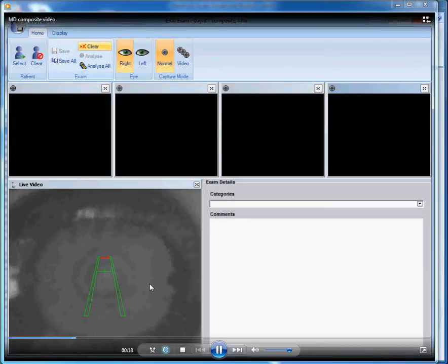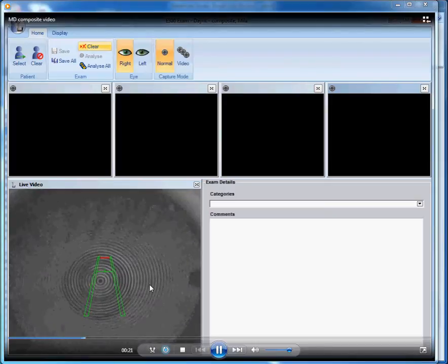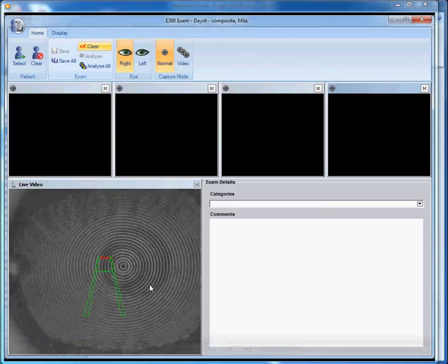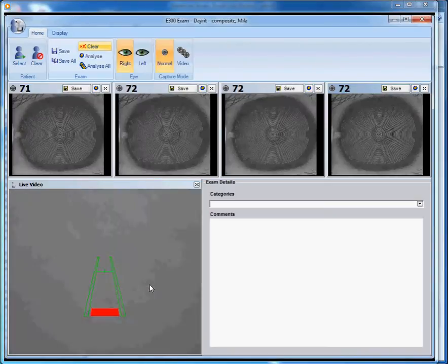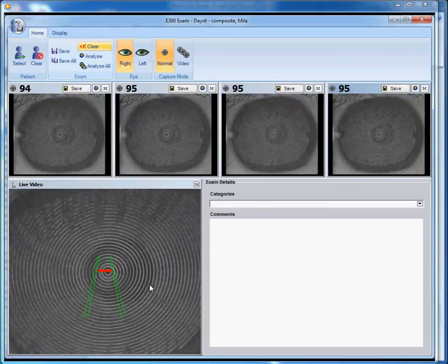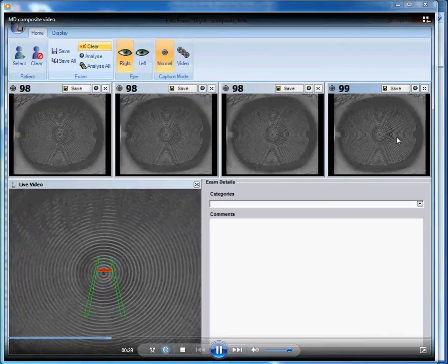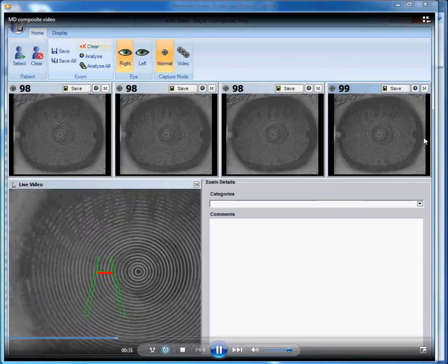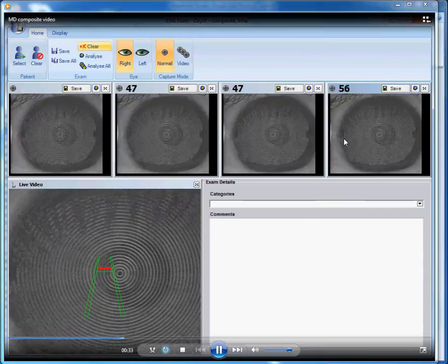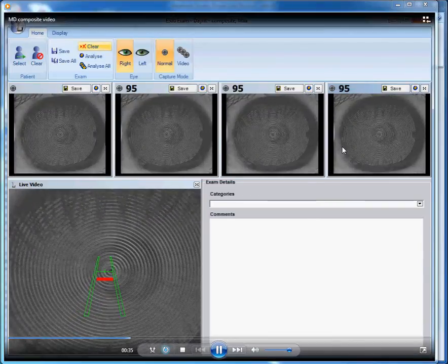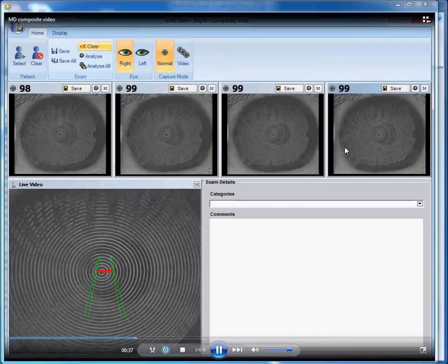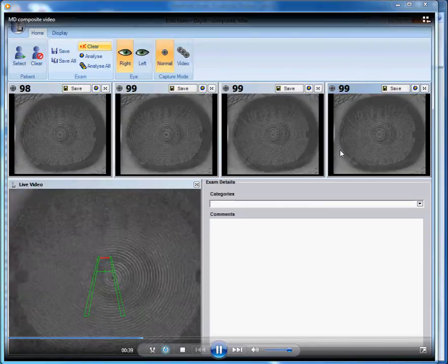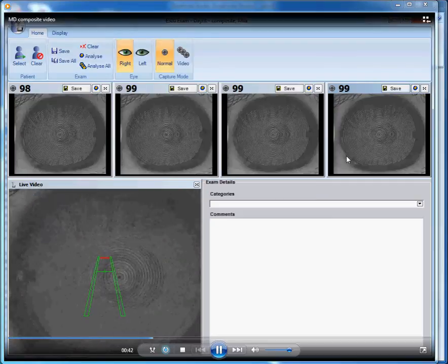Now we'll take our second image. In this case, we're going to have our patient look three rings to five rings toward the nose. This is a right eye. You'll notice how the patient is fixating toward the nose, which is going to push the rings toward the temporal side. We want to image the placido reflection when it's hitting the limbus on every aspect of the cornea.